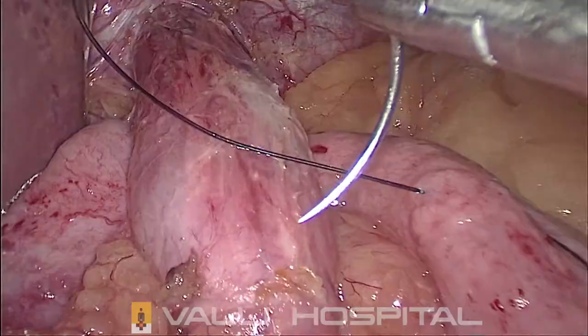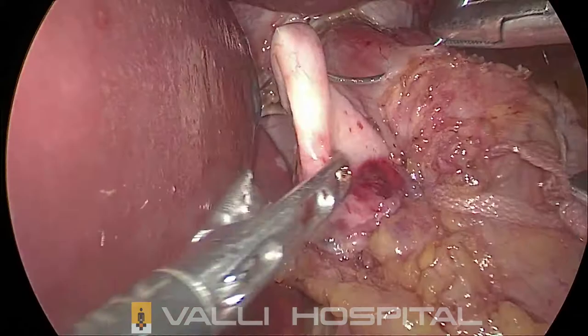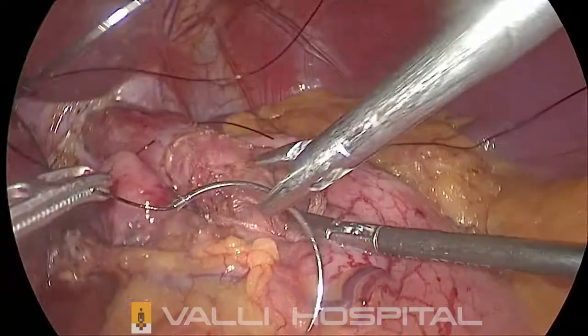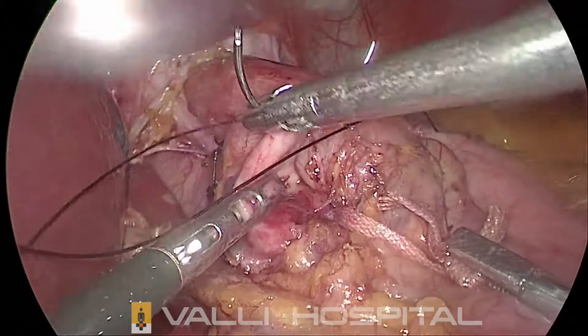That pad of fat can be removed, but we usually don't remove it. While taking the bite, you need to be careful about the anterior vagus. And this is the posterior wall. Take a good chunk. This we usually take as a U stitch. Take this bite very close to the previous bite. You should not come too low. If you come too low, the wrap will become very big.